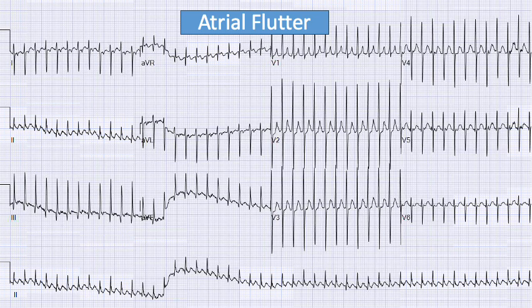And so if you look at enough ECGs for babies, when you see this pattern, and it's really often most evident in the limb leads, this wavy morphology of a baseline with a very fixed regular QRS, this looks like atrial flutter. If you looked here, you couldn't tell whether this was atrial flutter or SVT, but if you look here, these P waves give you some subtle clue that there's actually flutter waves in there. And if you gave this patient adenosine, you would see that.